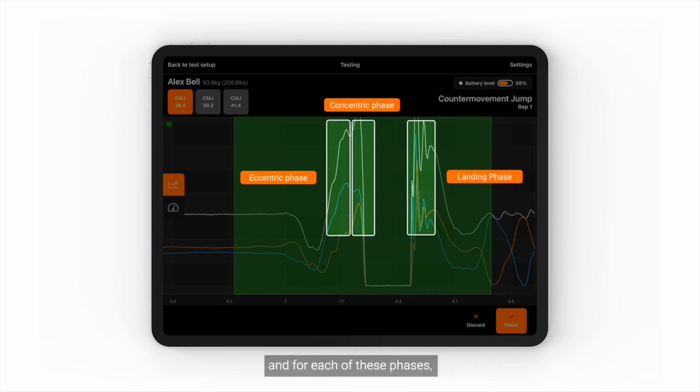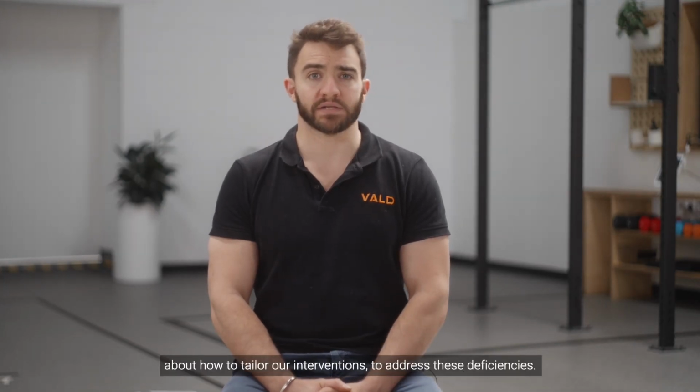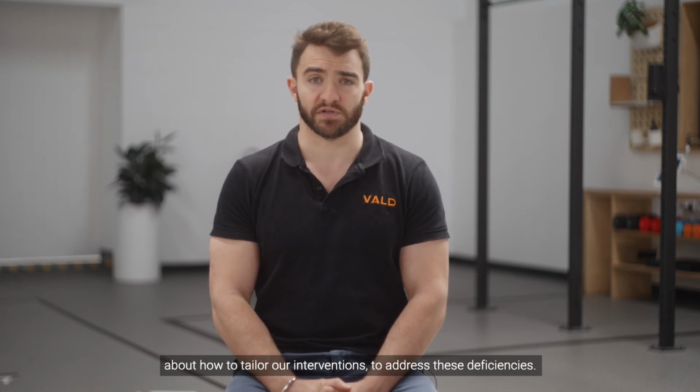And for each of these phases, there are metrics that measure the degree of asymmetry, allowing us as practitioners to immediately feed this information back to the athlete, as well as make on-the-spot immediate decisions about how to tailor our interventions to address these deficiencies.